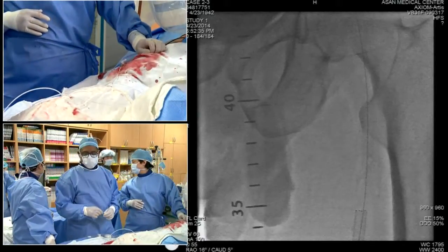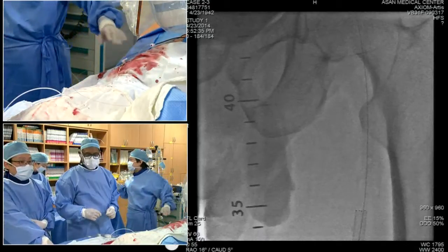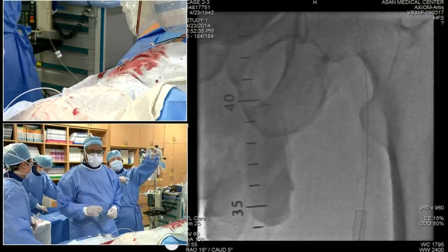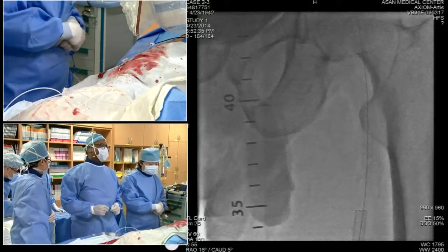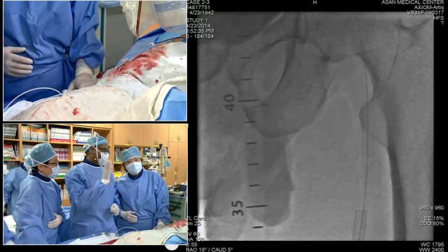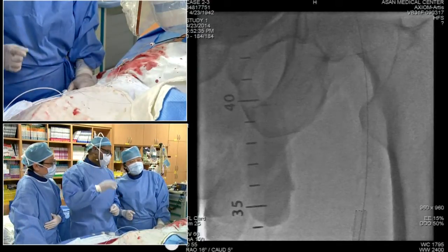What was the data outcome on Impact for the CTOs? Have you separated out the CTO data? How would you proceed? We have not yet analyzed the length or CTOs separately. Okay. So what was agreed upon? We're going to take a 6 by 120 distally and proximally throughout this whole stent and up in the native vessel?